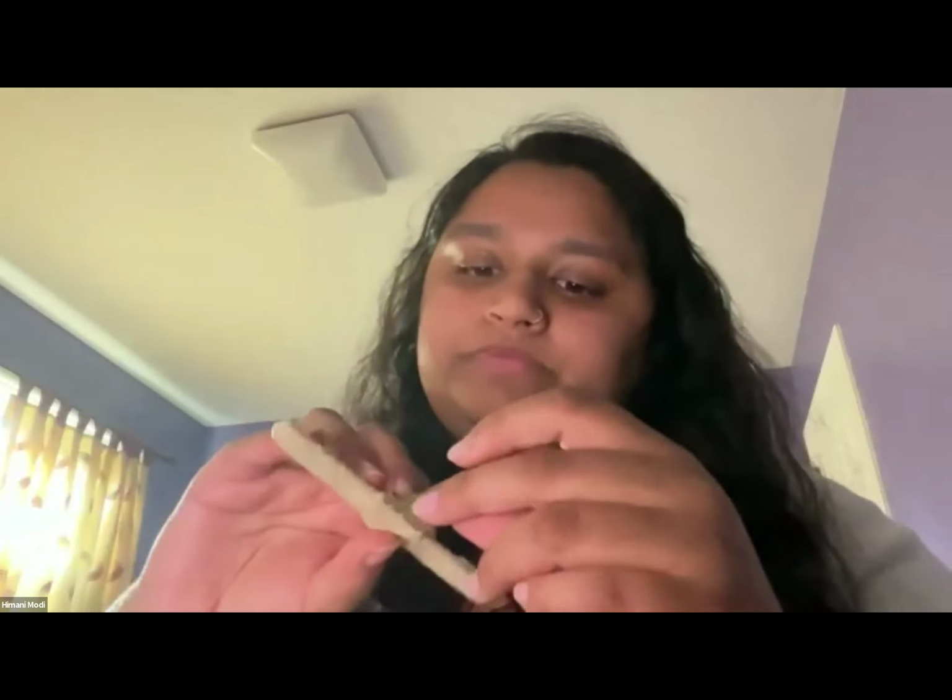Another upgrade or downgrade that I didn't really explain earlier was that this also makes it easy so that you can label each side of the popsicle stick in order to let him know, do you need to turn it this way or that way? So I felt like that was another option, but we didn't implement that because I don't think he really needs that downgrade. But if there comes a time where he's struggling a little bit more with the problem solving aspect, I could also implement that.